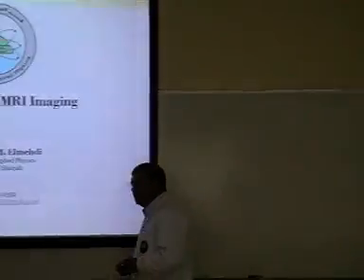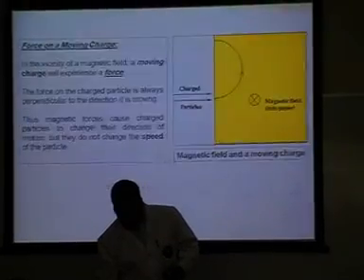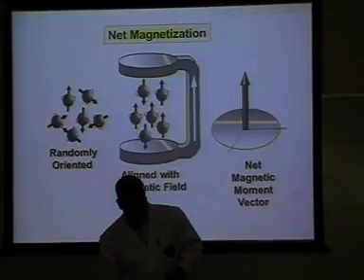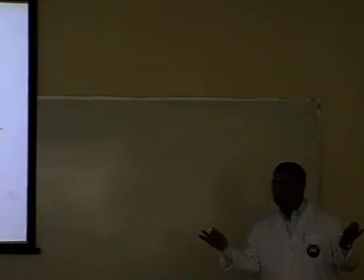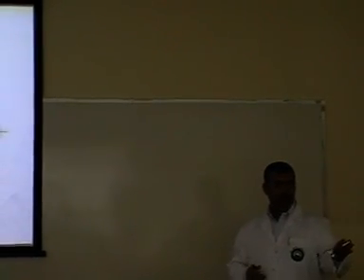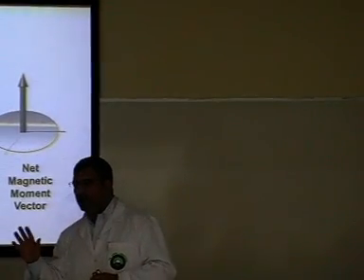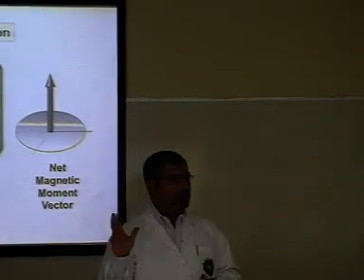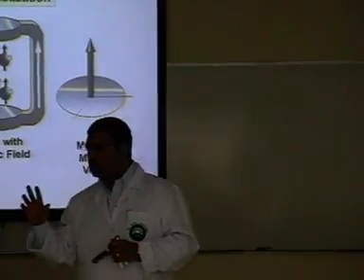Can just very quickly remind us where we were last time, and then I'll pull up the slide so that helps you to focus, or at least helps you to answer the question. Somebody? Okay, we'll start here. Okay, go ahead. No, just before that, let's just give us the idea of MRI. What's the idea behind magnetic resonance imaging, the physics behind it? Somebody, we're talking about something called magnetization, net magnetization vector, things like that.